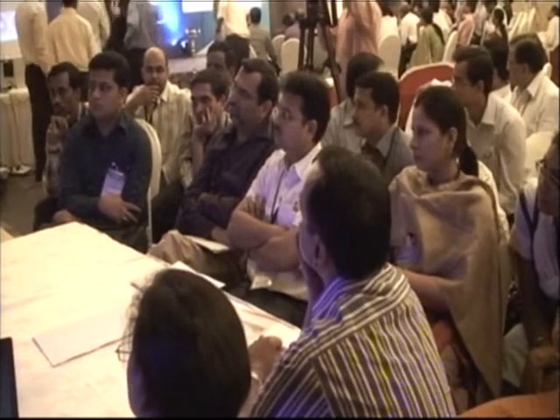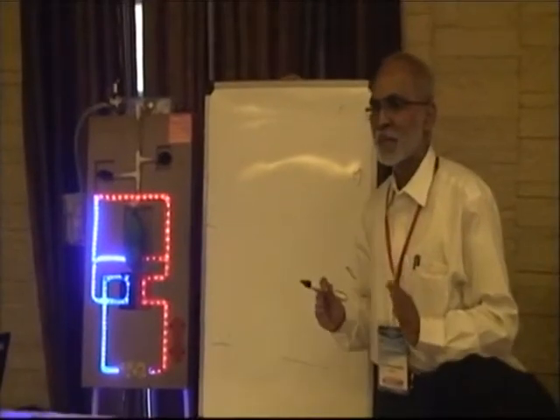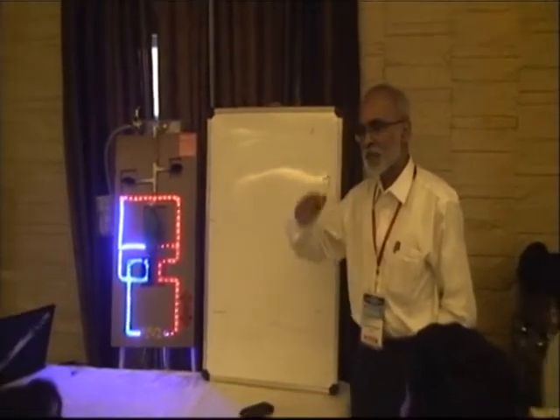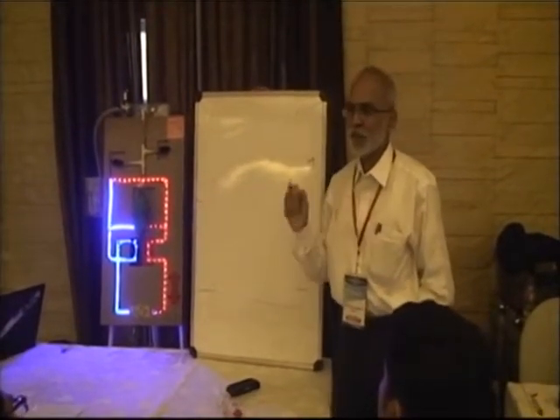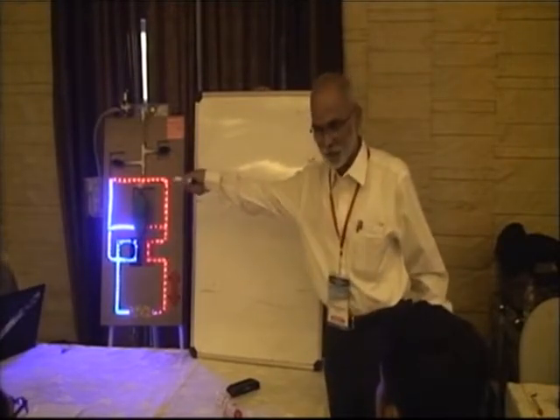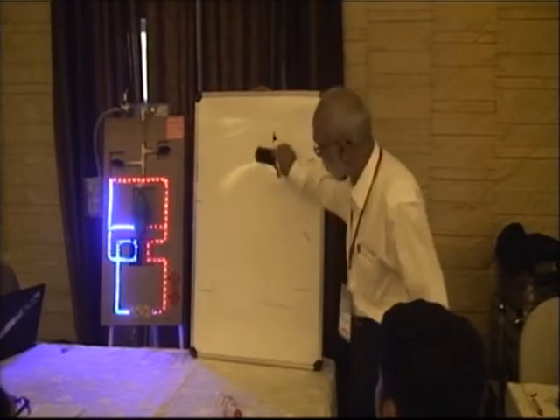See, we are on an advanced ventilation workshop. Some complex things will be discussed. They can be difficult to understand. But let's see, the patients who have, when we talk of airway resistance or airway compliance, we have discussed the heterogeneity of alveoli. The same is true even of airways. For example, there could be an airway.